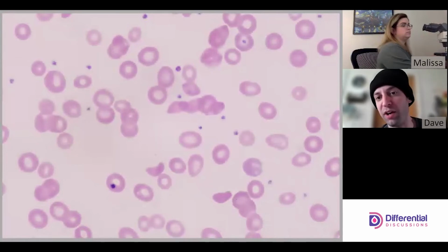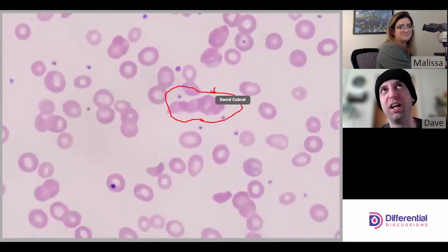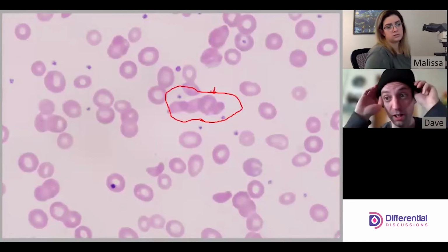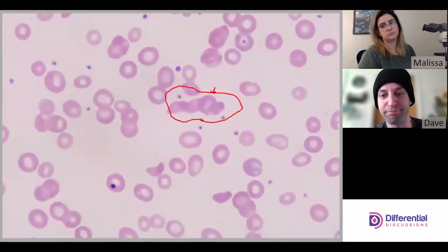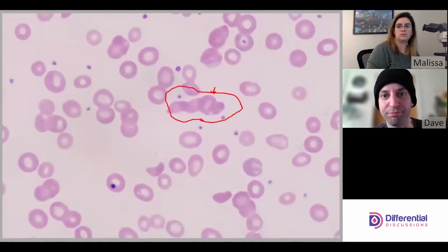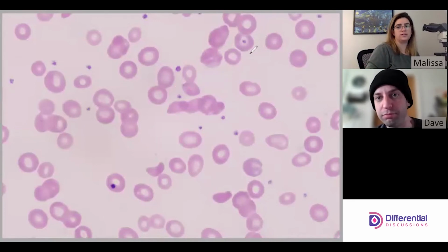Yep. And then, following the pattern, see another series of cells kind of sticking together. There may be a regular erythrocyte, well, not regular. It has hemoglobin S in it, but maybe a non-sickle cell there. But yeah, that sticky sickles. Even up here too. Yep. And then just to the right of that, there's another platelet on a red cell. Oh yeah, right in the central pallor. How pretty.